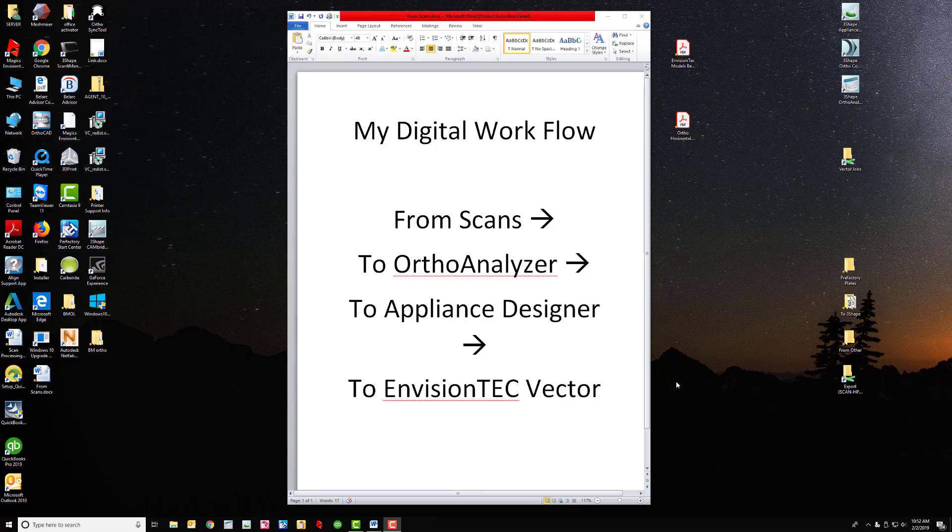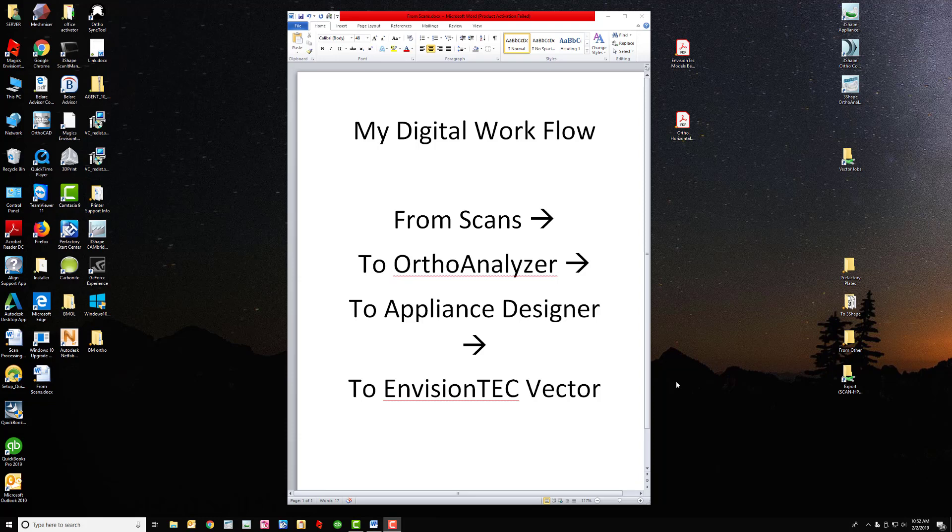Hello. I thought I would update this as I've updated my digital workflow. I just thought I would share what I do and see if it helps out anyone, and if anyone sees any ways that I can improve this, please let me know. This is my digital workflow from scans to orthoanalyzer to appliance designer to my Envision Tech Vector.